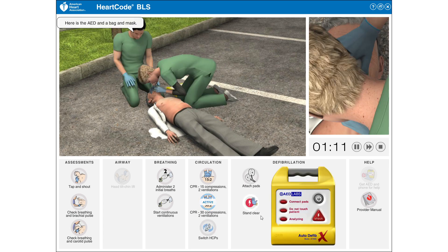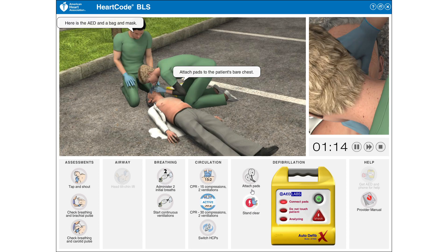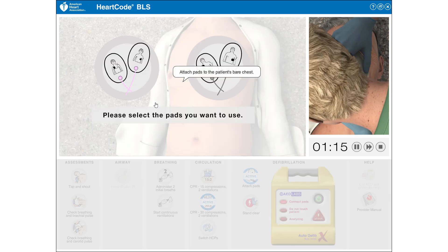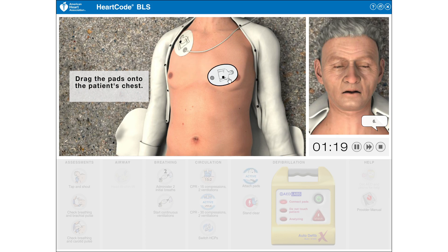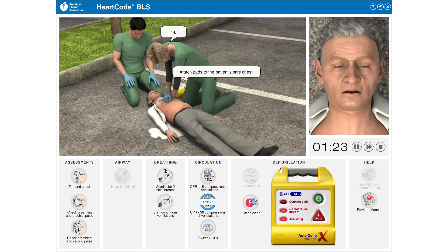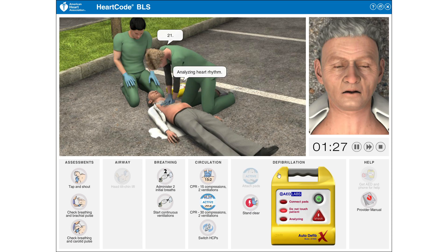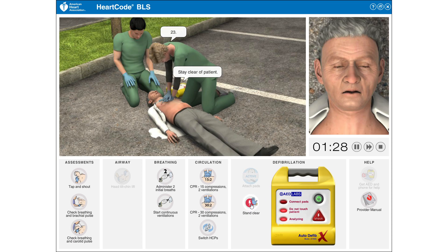Here is the AED and a bag and mask. Attach pads to patient's bare chest. 1, 2, 3, 4, 5, 6, 7, 8, 9, 10, 11, 12, 13, 14, 15, 16, 17, 18, 19, 20, 21, 22, 23, 24, 26, 27, 28, 29, 30. Stand clear of patient.